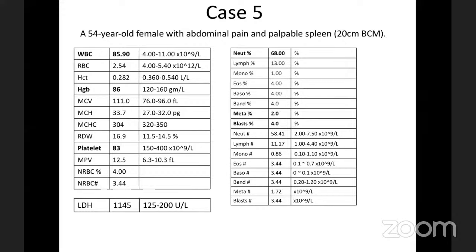And the leukoerythroblastic blood picture, by definition, is having left-shifted granulocytes, up to the stage of circulating blasts, together with nucleated RBCs in the peripheral blood. So these patients have leukocytosis with a leukoerythroblastic blood picture. And from the laboratory, you would notice that the patient has a very high LDH. So: splenomegaly, high LDH, leukocytosis, leukoerythroblastic blood picture, adult patient.